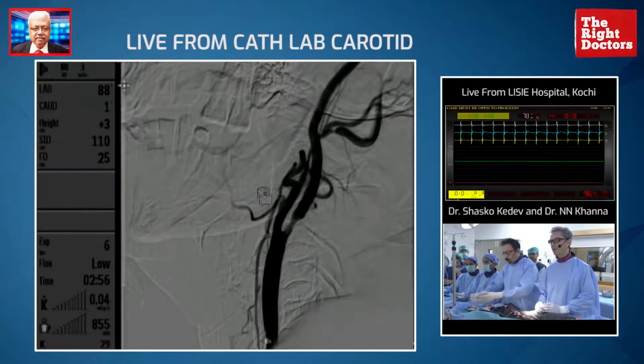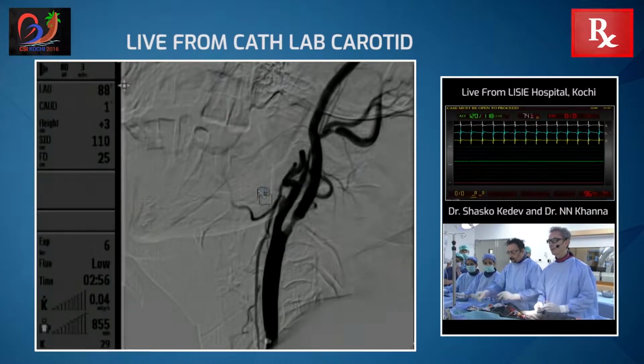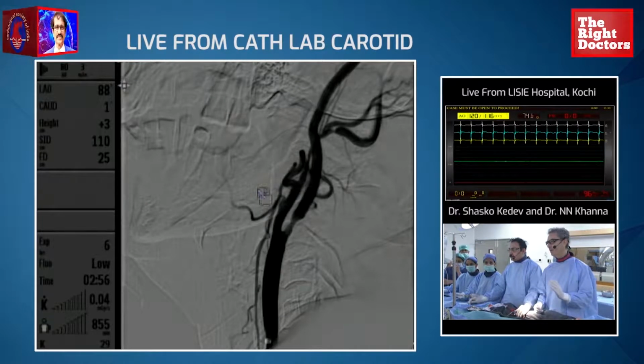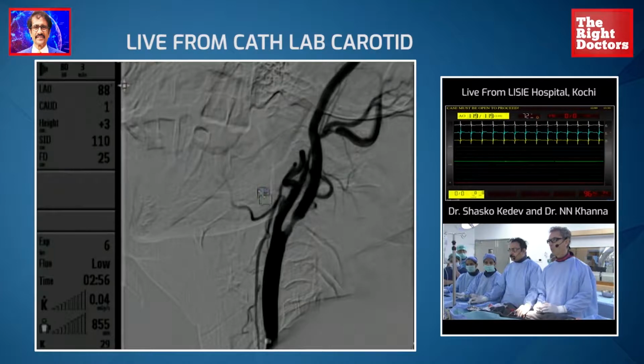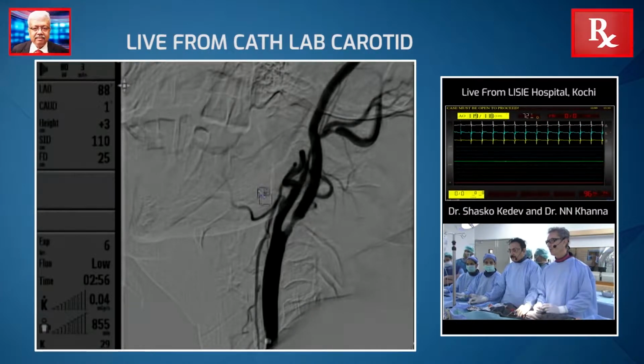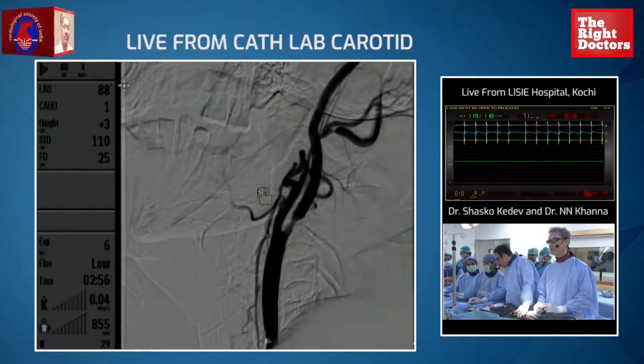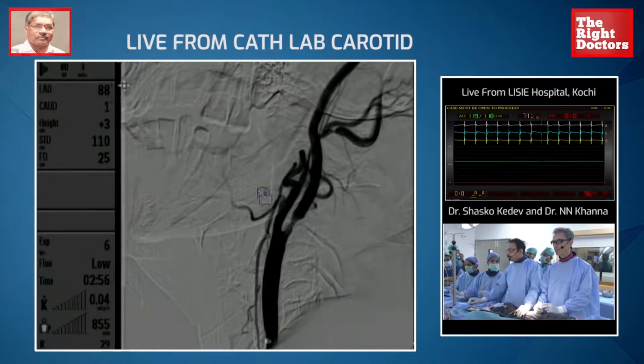This is a perfect case for a carotid indication. As mentioned previously, a 60-year-old female with an acute or subacute stroke 10 days or 2 weeks ago, without morphological change or brain changes on CT. So it means a clear indication of carotid revascularization.